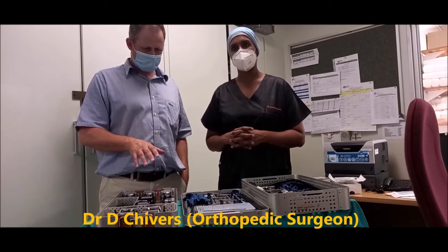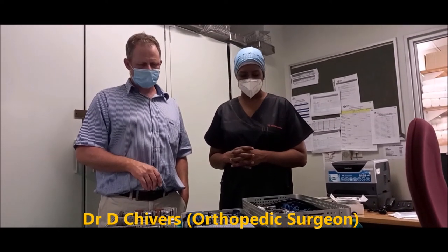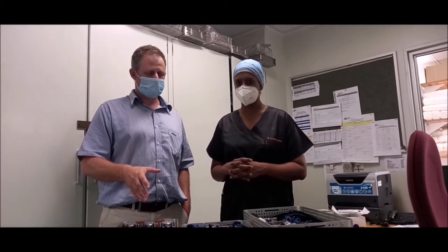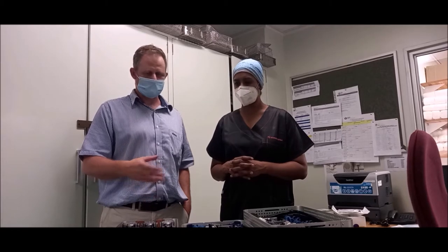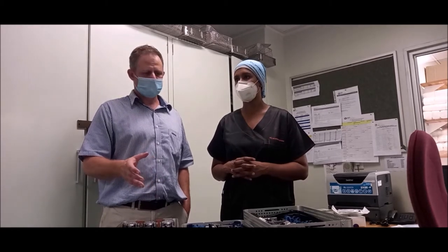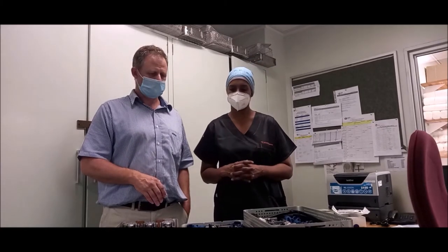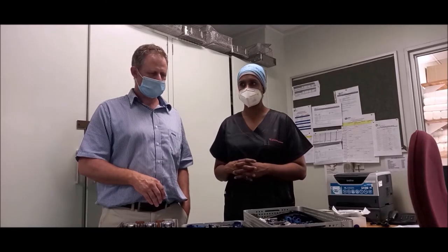I'm going to show you the Navio, which is a robotic assisted knee surgery system for knee replacements. This takes the guesswork out of doing knee replacements and increases accuracy from a 3 degree human error to a 0.1 degree human error rate. So it's a very accurate way of doing knee replacements.